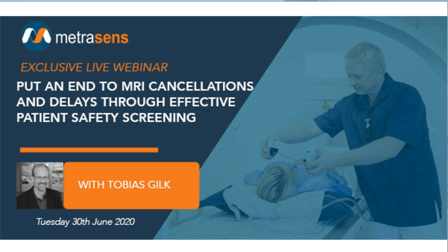So that's not without risk, and I am not here to suggest that we take the radiologist out of this risk assessment structure, because this ultimately becomes a clinical risk-benefit question. We have to weigh the potential value of the study against the potential risks of proceeding with it. And that ultimate determination belongs to the radiologist to perform.